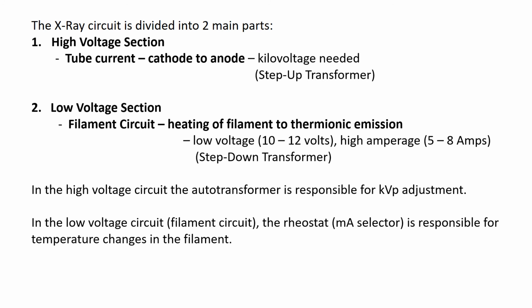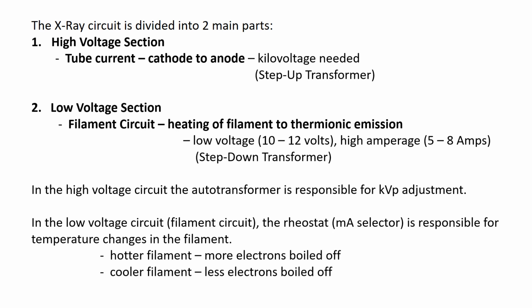So, what do we do when we take an X-ray? We adjust the kilovoltage. Now we know that that's really going to be part of the job of the autotransformer. And we're going to adjust the MA values. This is the job of the rheostat or the MA selector. As I mentioned, hotter filament, more electrons are boiled off, greater thermionic emission. Cooler filament, less electrons are boiled off.